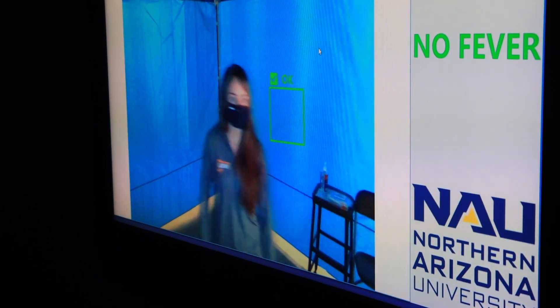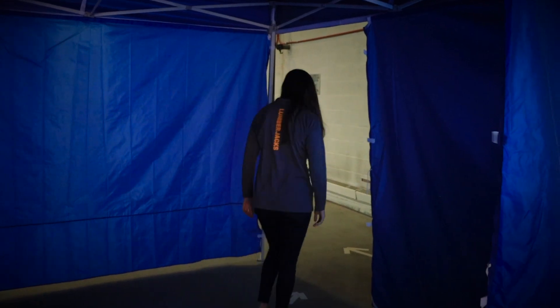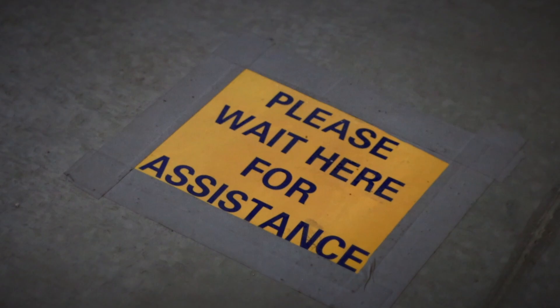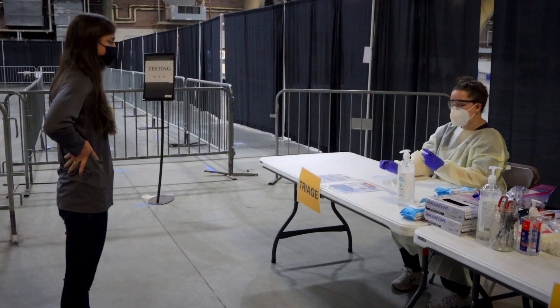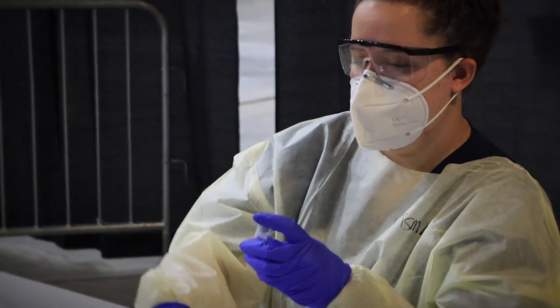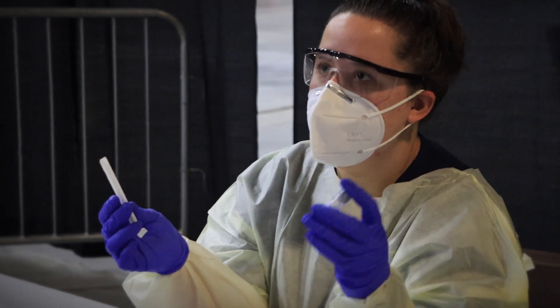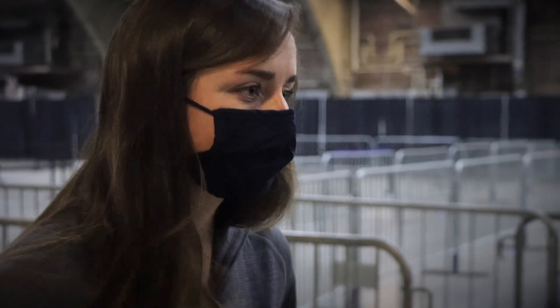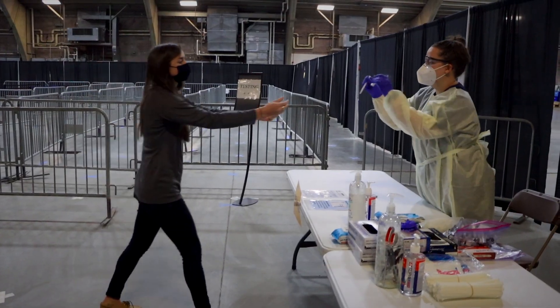After you get the green light, continue to the test tube pickup. Make sure to follow the signage and floor markings seen throughout the testing site. You will be asked to provide your date of birth. Then you'll receive a test tube for the saliva sample and a straw that you will use to spit. You will be directed through the testing process and taught how to properly produce a saliva sample.